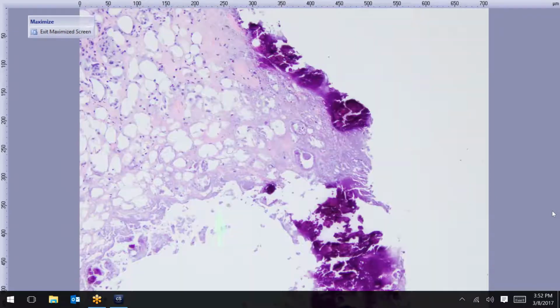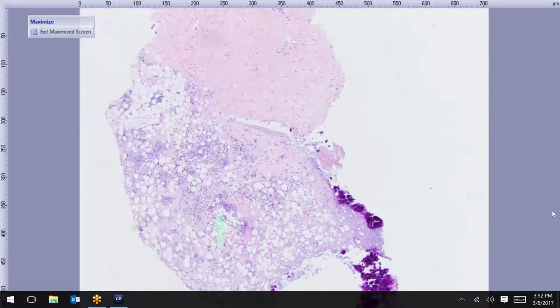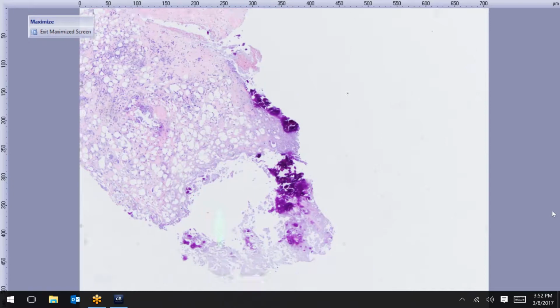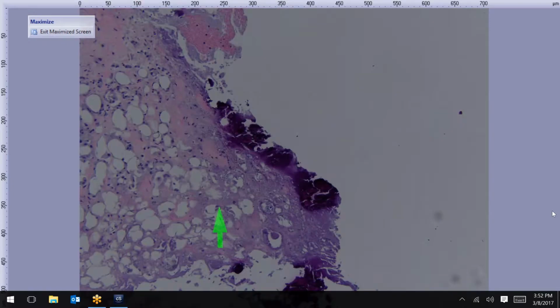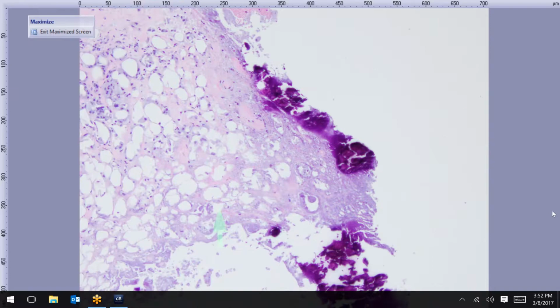And so anybody want to type in or say a diagnosis? That's perfect, that's right. Pancreatic panniculitis. So this is one of those conditions that is basically classic. This kind of ghost cell appearance with calcification. There's really nothing else that looks like this.